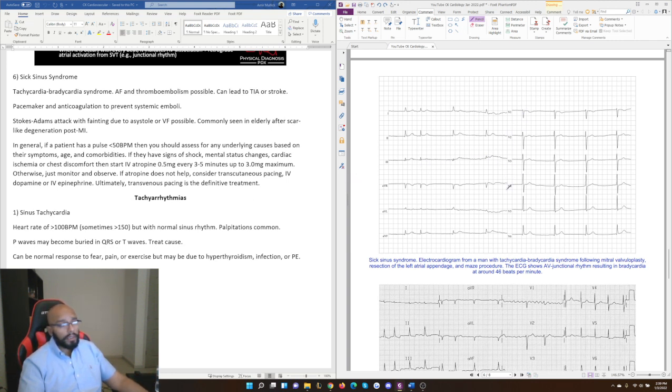If you look at this ECG, it's kind of designed in a weird way. You have your V1 through V6 on the right side still, but not the same way we usually look at it. It's usually V1, V2, V3, and then V4, V5, V6, but they put it like this. Either way, if you look at it, lead aVR is pointing down like it should. Lead V1 is pointing down like it should. So those two things are going good. The pencil is not working too well anymore because I guess I've used it for too long.